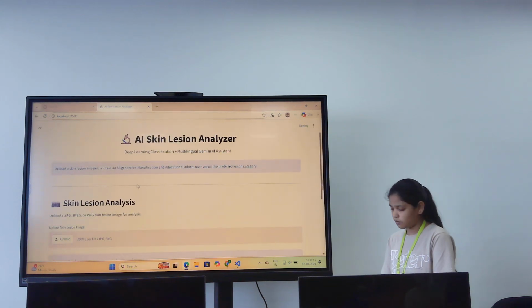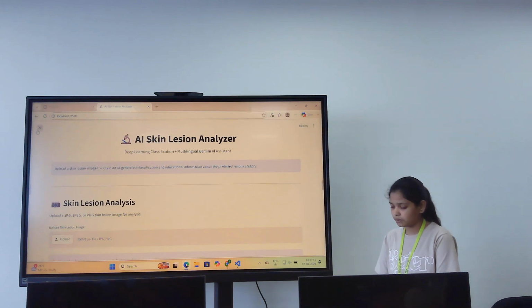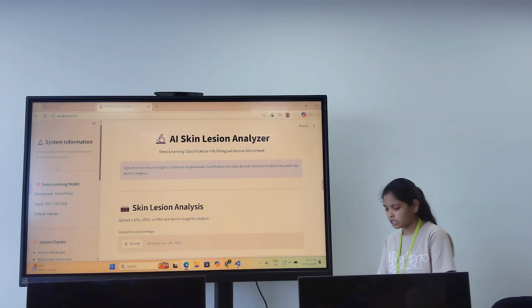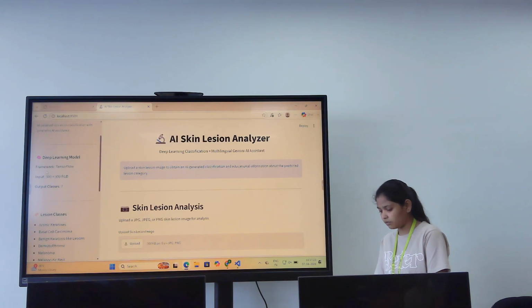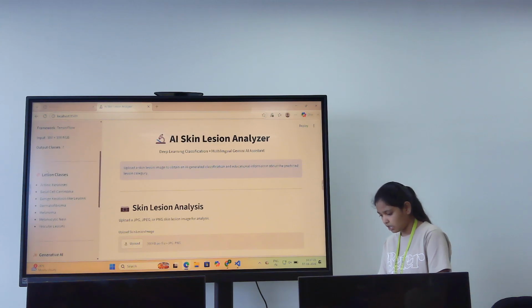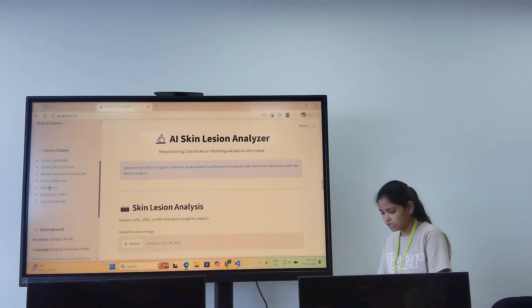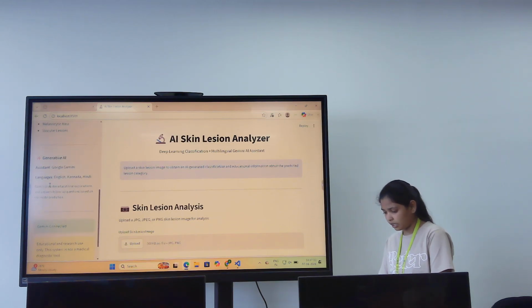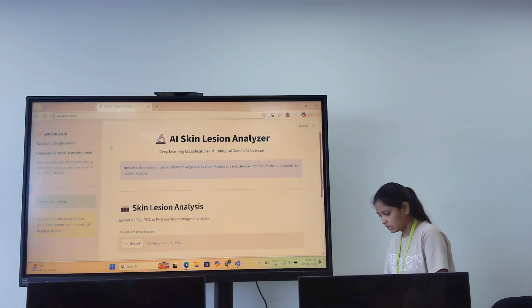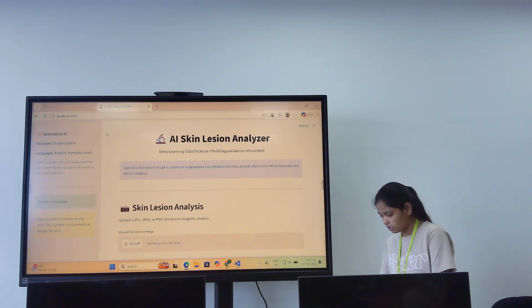This is my homepage. Here we see the sidebar. This is about the system information. Here it gives deep learning frameworks and information. And these are the lesion classes, the diseases of the skin. And for generative AI, I use Google Gemini. And we can also switch between Kannada, English, and Hindi languages.